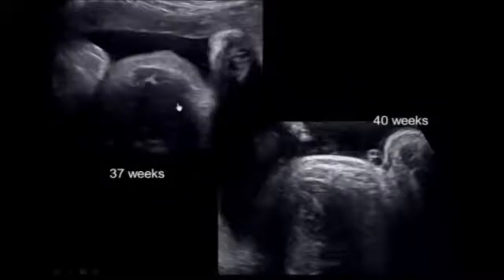Another case seen at 37 weeks by a member of my department, and a mass was seen in the thoracic wall. Here's the apex of the heart, and you can see a little hypoechoic abnormality in the subcutaneous tissue of the chest wall at 37 weeks, unclear etiology. Well, I was able to scan the patient 3 weeks later when she came in for a biophysical profile. Here's the apex of the heart, and you can see that hypoechoic structure again. Notice there's another hypoechoic structure right here, and this is a female fetus, and this is a little bit of breast tissue seen bilaterally, so a completely normal finding.